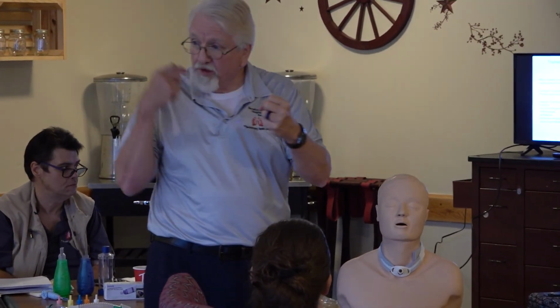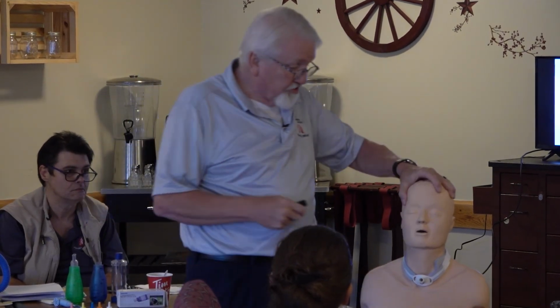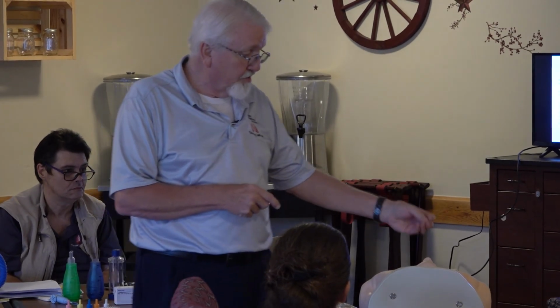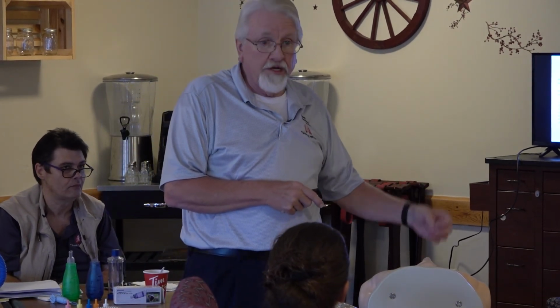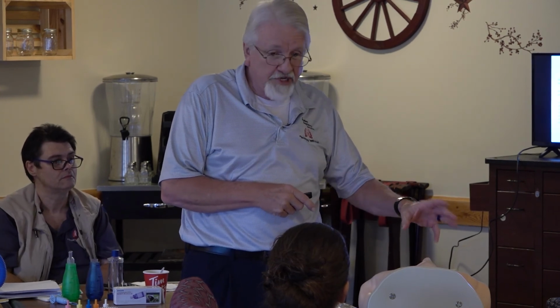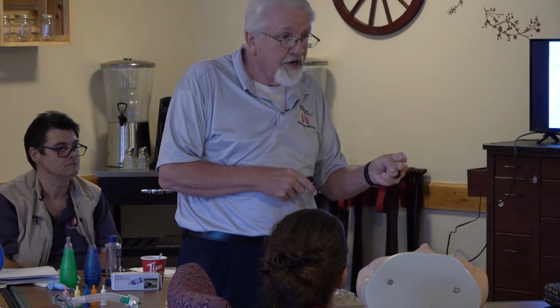One thing I did not cover that has happened occasionally over the years: some respiratory patients will have what we call floppy airways. You stick the catheter down in there, and usually when you get to the carina or feel resistance, most of the time they'll start coughing a little bit.